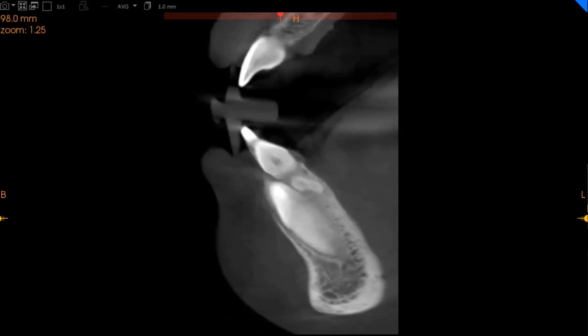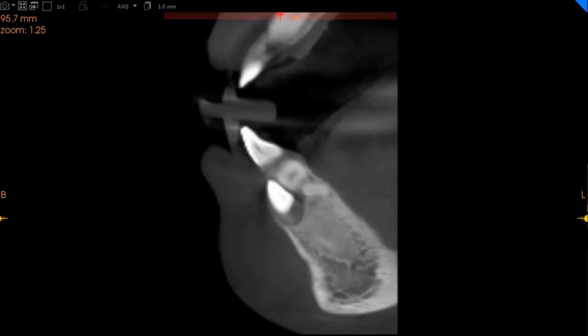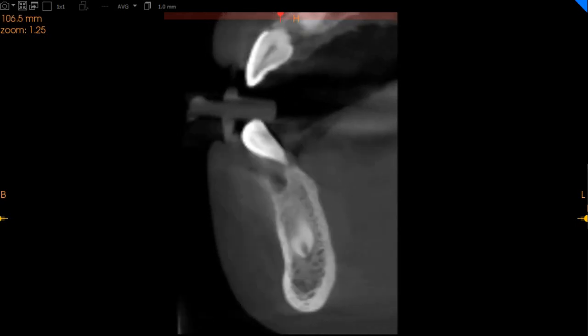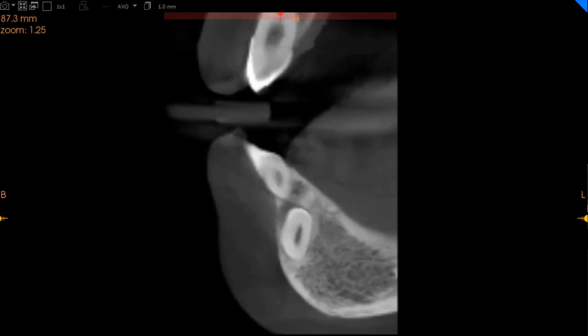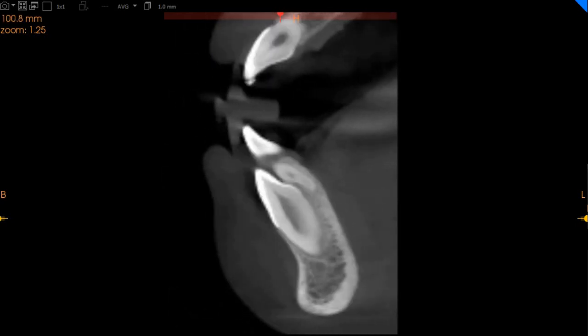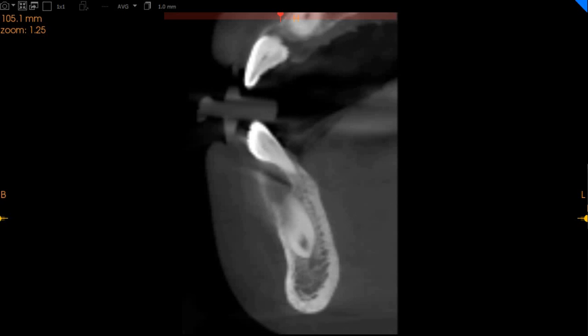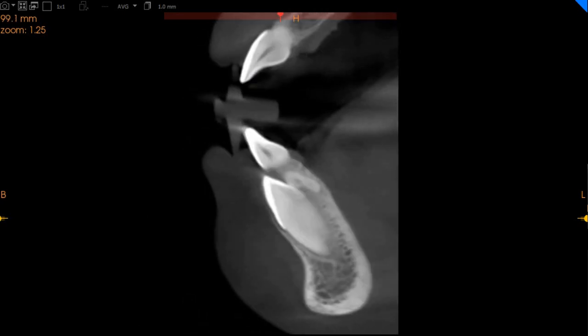Also to note, we do not see any cystic lesions or any significant pathological radiolucencies associated with these impacted canines.